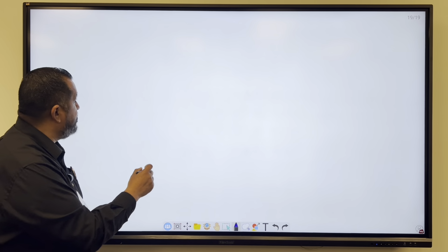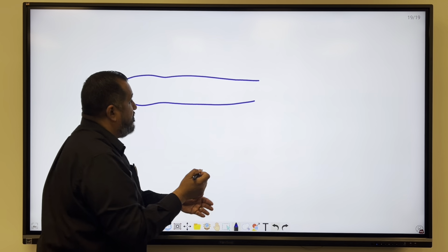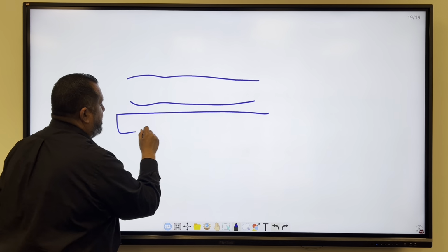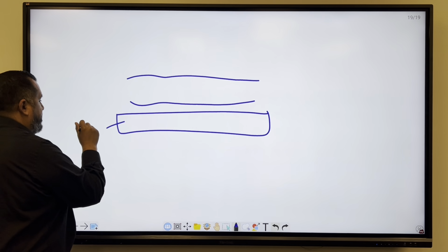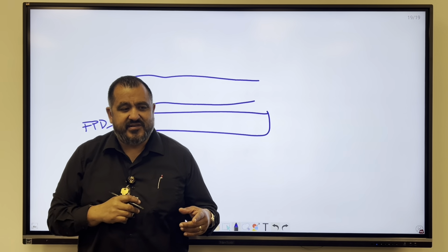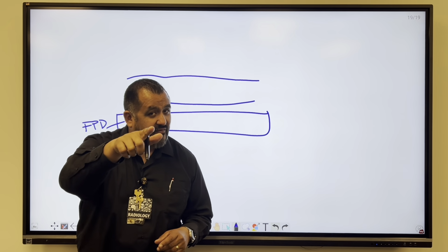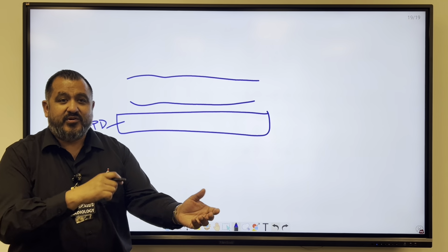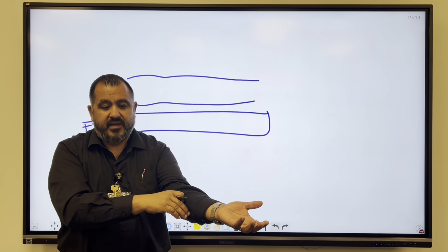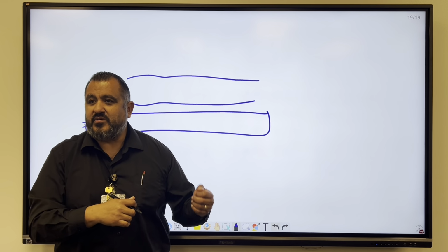All right, so now let's go ahead and make the exposure. Okay, so I'm going to put my forearm here, just like this. Let's create an image using a flat panel detector, okay? So you set your mA, you set your kV, you set your SID, everything's there. You collimate, right? Put your marker, don't forget your marker. I don't like this annotation stuff. We're doing a left forearm, so you put your left marker here. Now you give your patient instructions. You're going to make the exposure, correct?